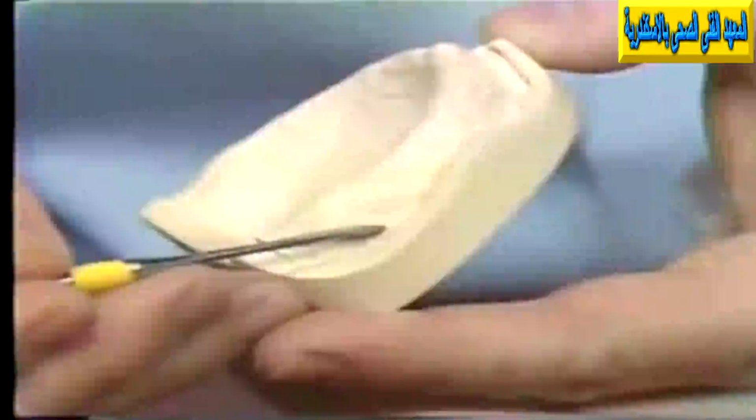Now, if this strip were added to the compound in an area such as this, it is considered too low on the impression. And as you can see, or can imagine, if this were poured in stone or cast in stone, this whole area of the flange would be embedded in the stone. This would result in the master cast having a very deep area along the border area that I'm pointing out here, and it would make it difficult for the rest of the procedures, such as waxing the denture or even making base plates.